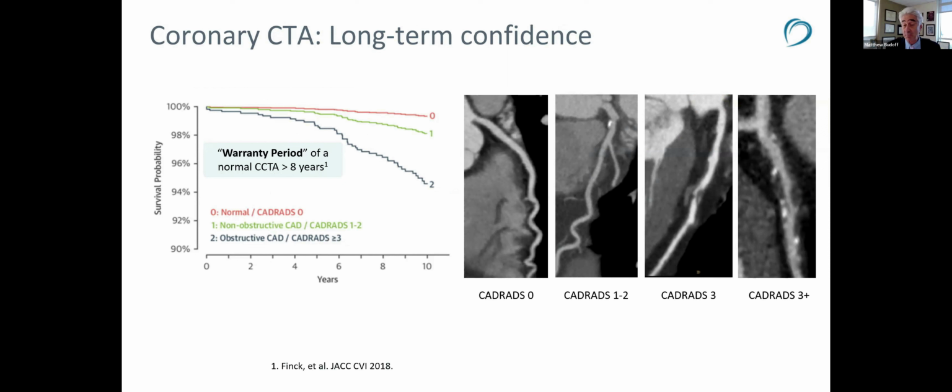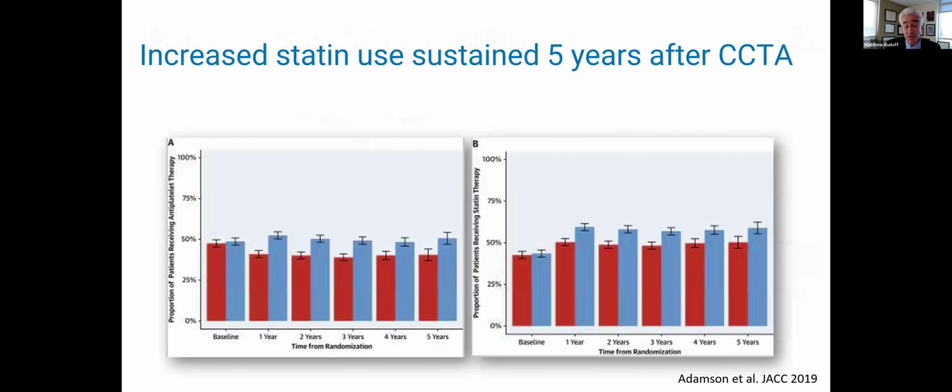And as we find more plaque in the coronaries, here defined as CAD-RADS for percent stenosis, you can see worsening outcomes over long-term follow-up. We're also all familiar with this simple concept that a picture is worth 1,000 words, that you show people plaque in their coronaries and they will behave better. Seeing is believing has truly been something that we've all experienced, both with coronary calcium and now even more so with cardiac CT angiography.